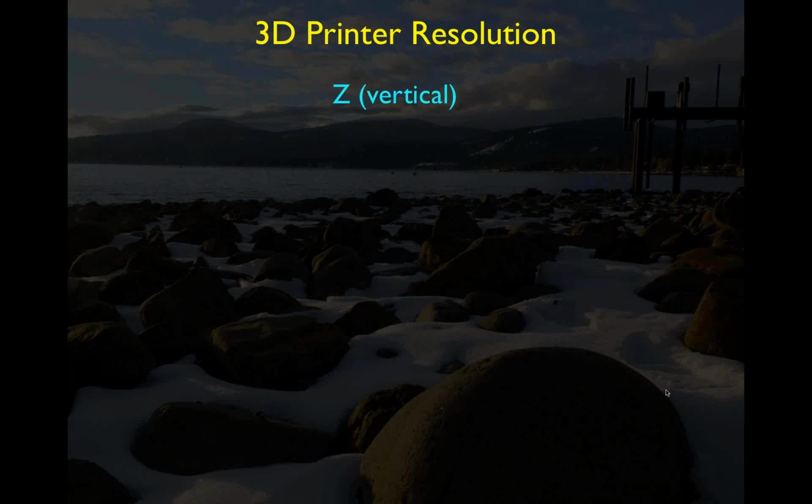There's what we call Z resolution, which is vertical. The Z axis is the vertical axis, so the taller the object, the longer the Z or vertical axis is for that object. And then we have XY, which is horizontal, two-dimensional horizontal, which really is the images that comprise each layer. As we build the layer, the Z would be a measure of the thickness of each layer.